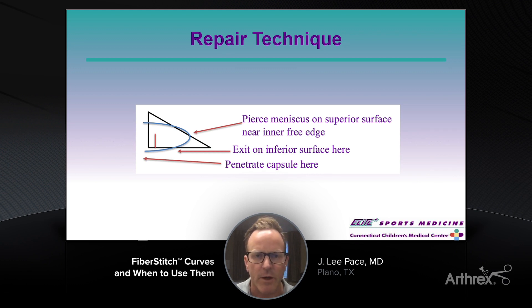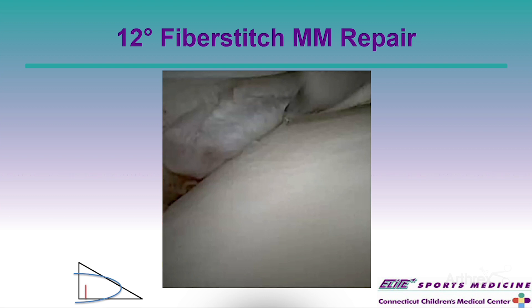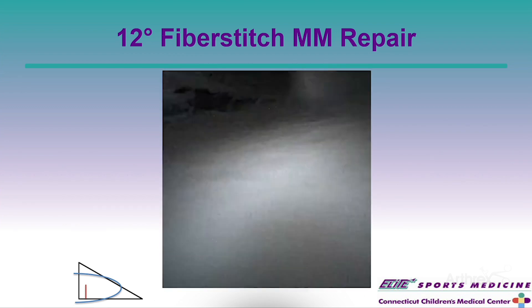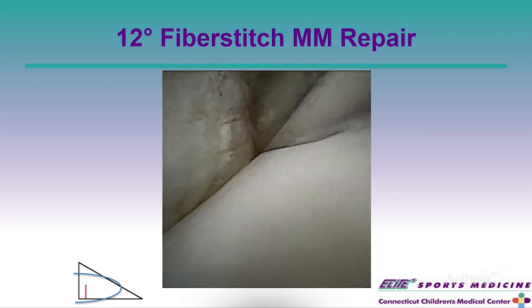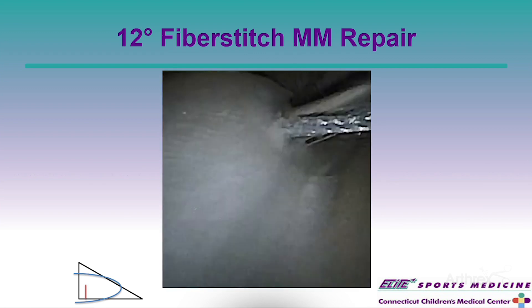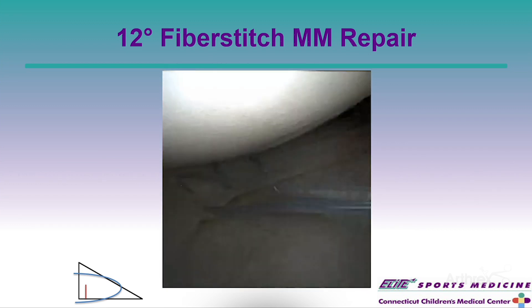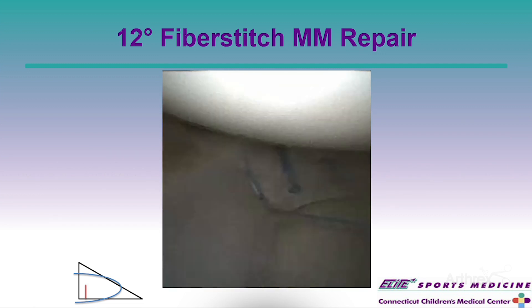This is a really nice technique and has been a workhorse for me. Here's an example - I have a nanoscope camera, hence the square on the screen. This is that exact tear pattern. The video starts with the needle of the Fiber Stitch underneath the meniscus as I size it up, then I come back to place the anchors. I poke through from top to bottom, through the meniscus, onto the undersurface, deploy the first anchor, check my sutures, then deploy the second anchor and tension the knot.